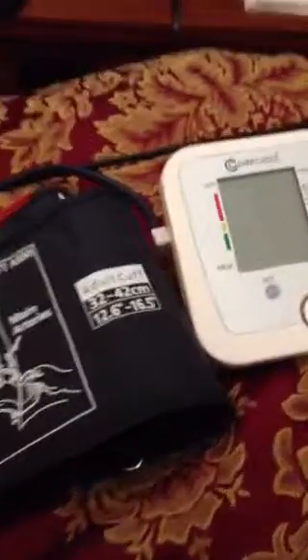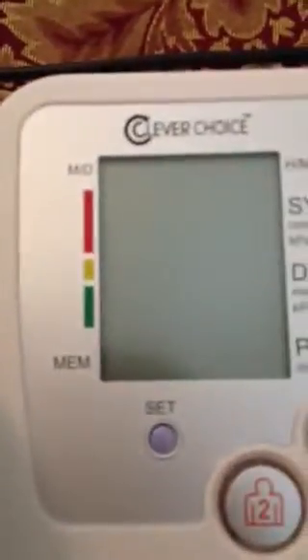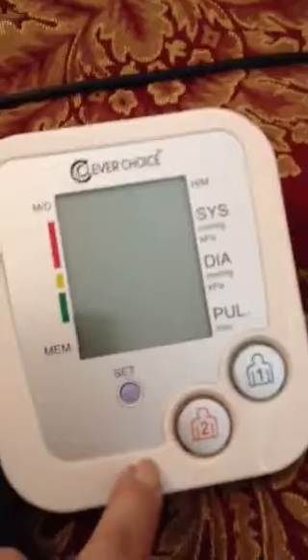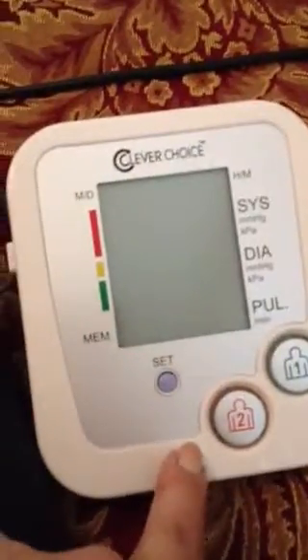Hello there. I'd like to very quickly show you this Clever Choice Blood Pressure Monitor. One of the nice things about it is it has this little graph here that can let you know if you're in a dangerous point. It's good for two separate people and it will hold their readings.